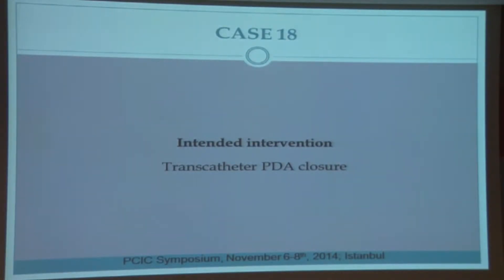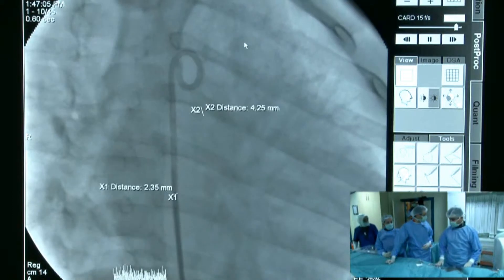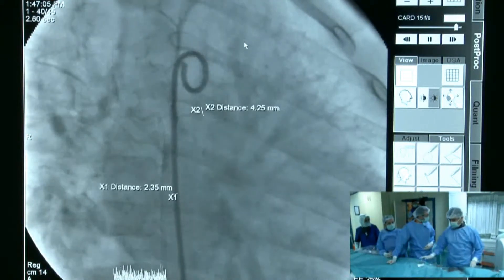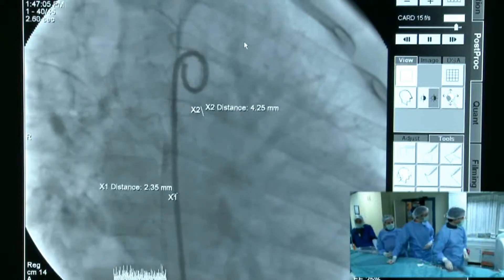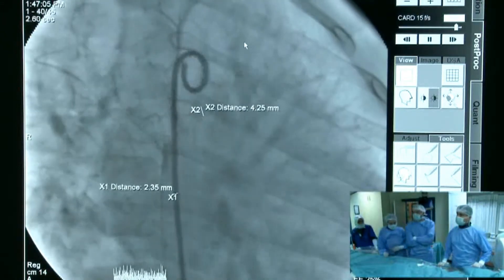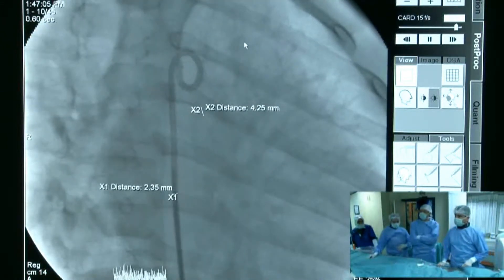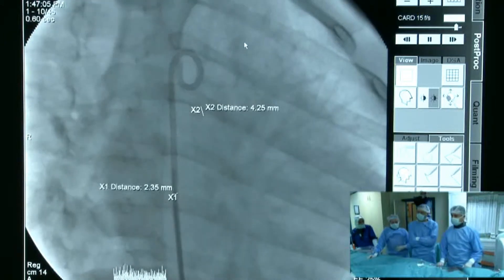The intended intervention is transcatheter occlusion of the PDA. We performed angiograms in right anterior oblique and left lateral projections.